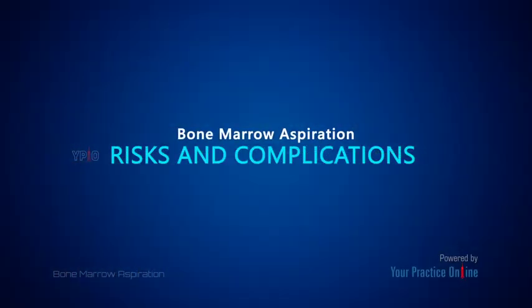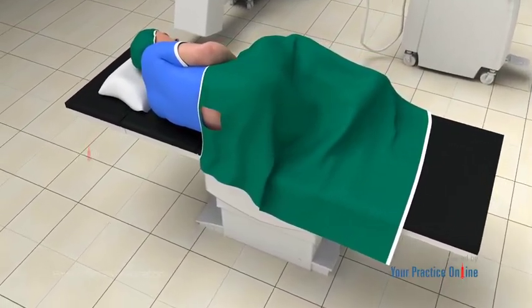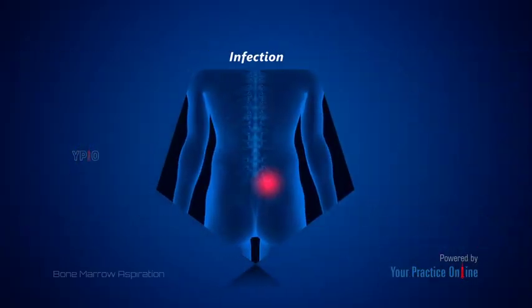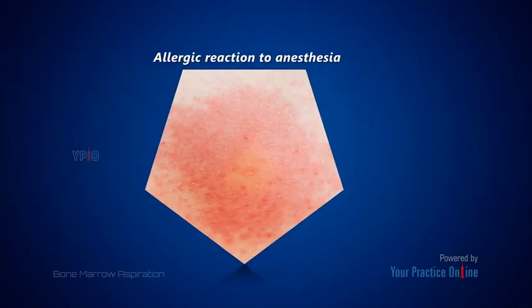Risks and complications. Bone marrow aspiration is a safe procedure with minimal risks and complications that may include excessive bleeding, infection, lasting pain at the needle insertion site, allergic reaction to anesthesia.